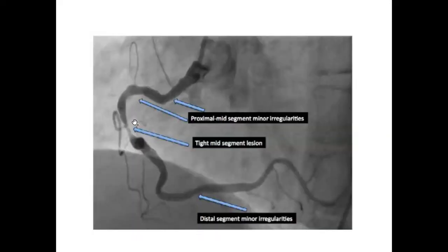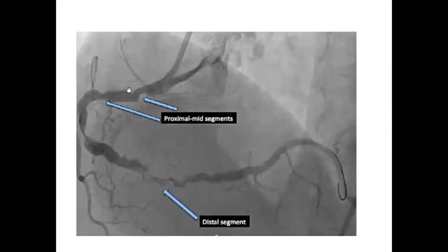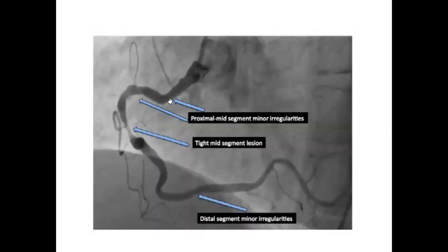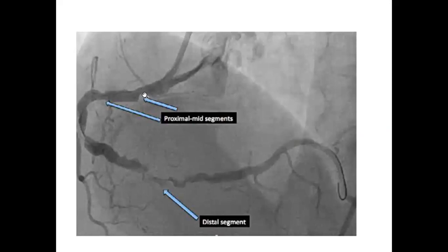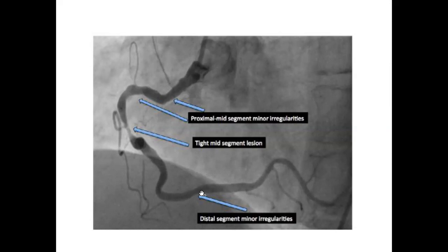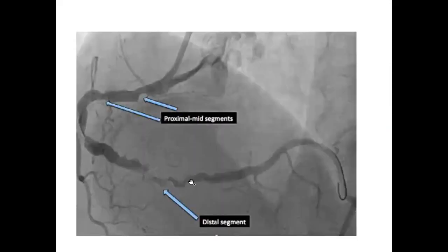This patient was planned for angioplasty, so a wire was placed. After putting the wire, you can see that straightening of the vessel has occurred. The proximal segment, which initially did not have much disease, now appears to have a lesion due to stretching and invagination of the tissue. The distal segment, which was quite normal with only mild irregularities, now shows a lot of beaded appearance and looks completely diseased — all because of the stiff wire.